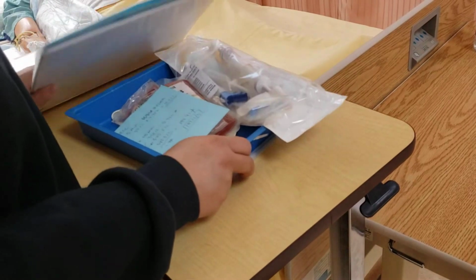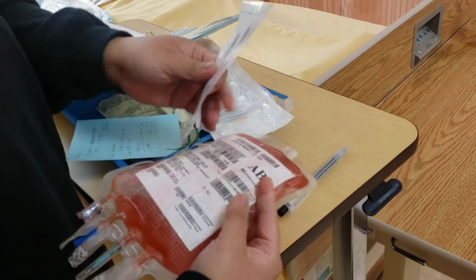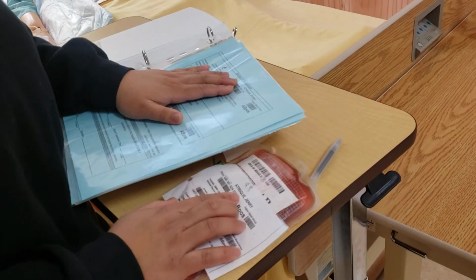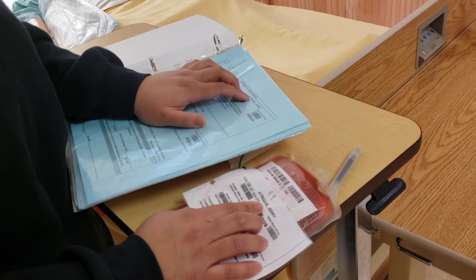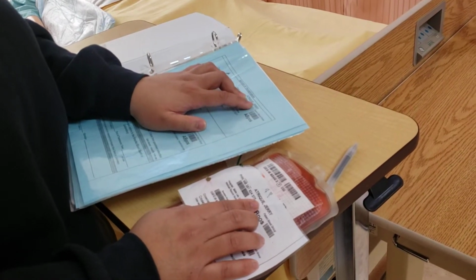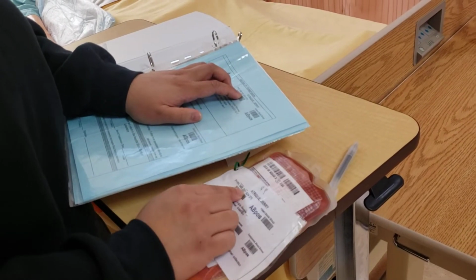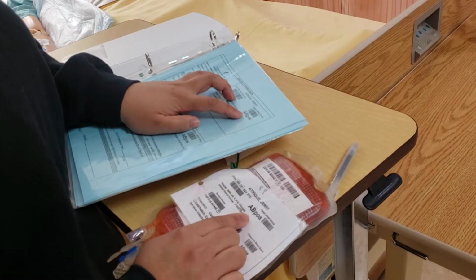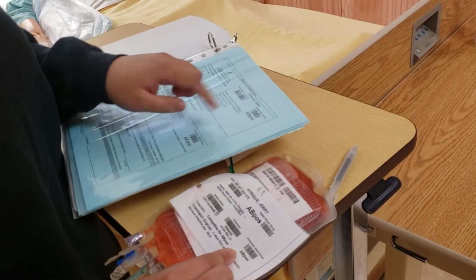And then my second check is gonna be the record of transfusion against the blood tag. So I'll check the record of transfusion. My second nurse would check the blood tag. So last name is A-T-R-I-Q-U-E. First name is Jerry, J-E-R-R-Y. PIN number is 261-824-375. Patient's blood group is AB positive, and the component blood group is AB positive. So we know those are compatible.